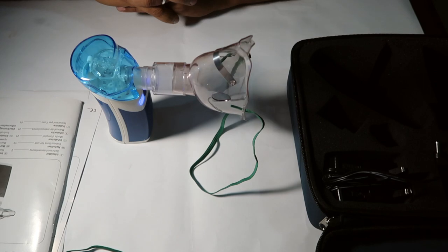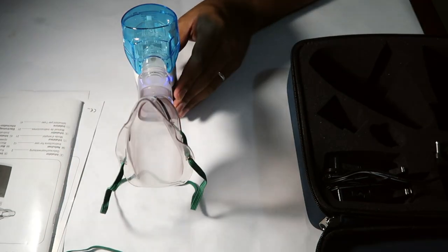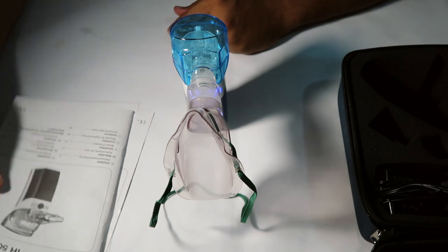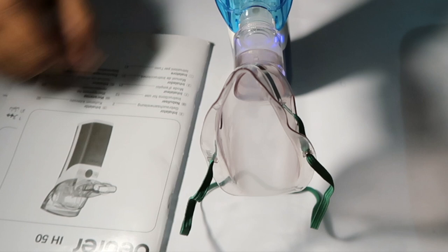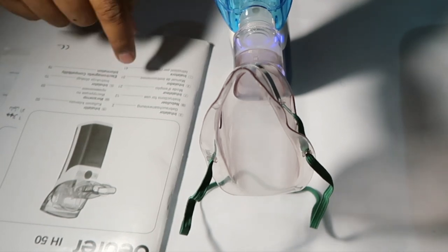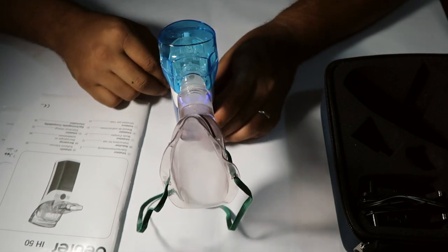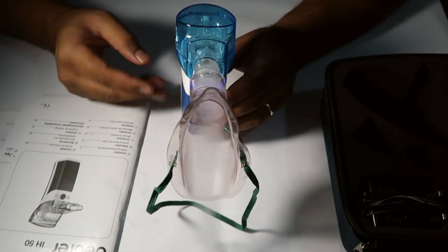If you want to use this device, you will be able to. This device is $700 to $750 and is available in many brands in the market. It is very easy to use, compact size, and lightweight — about 230 grams.